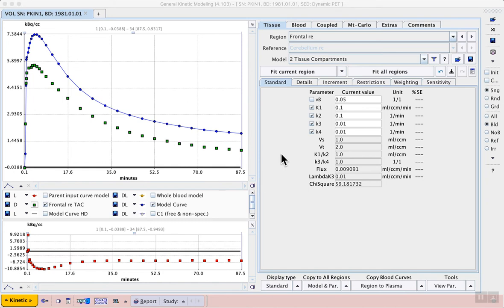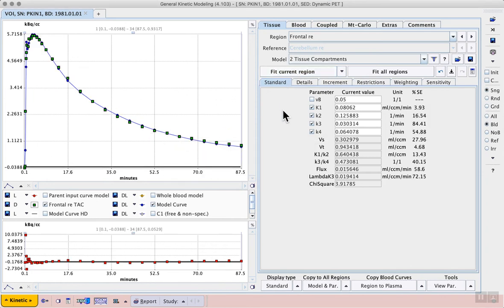The first model fit can be tested by clicking fit current region. Then using iterative methods PMOD finds rate constants for the model that produce the best agreement between the blue model curve and the measured PET data.